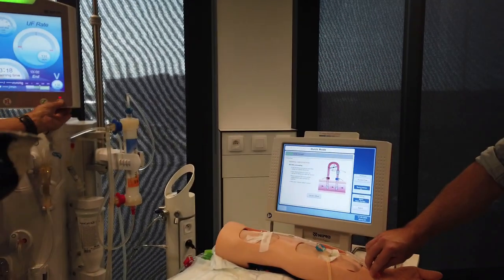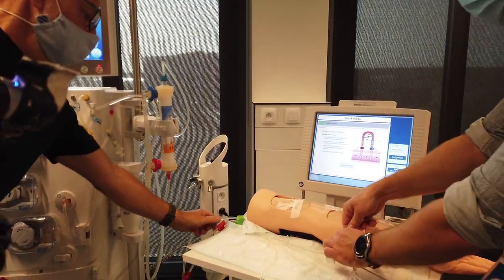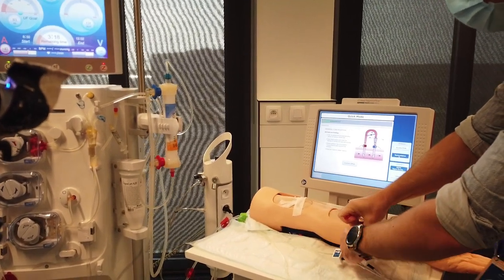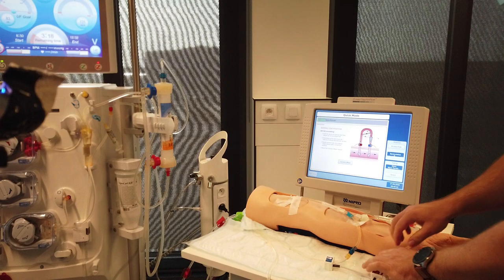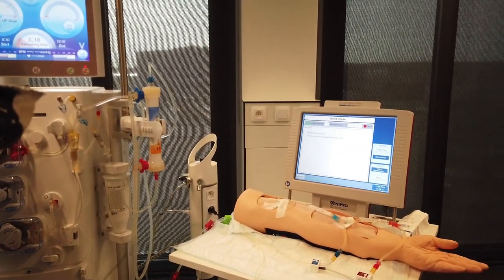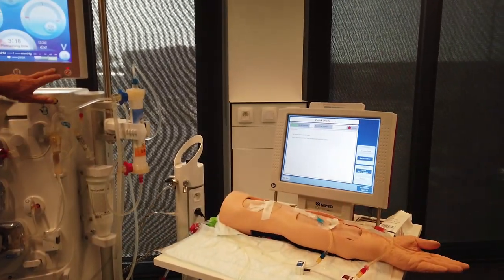Stop the blood pump, close the clamps on bloodlines and needles, and return the bloodlines to the correct position. Press offset and keep the clamps closed. After successful offset, open the clamps and restart the blood pump.